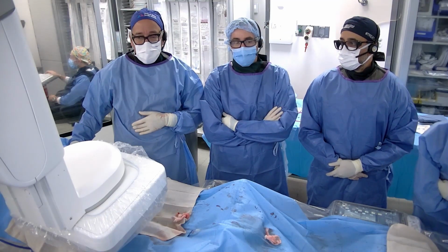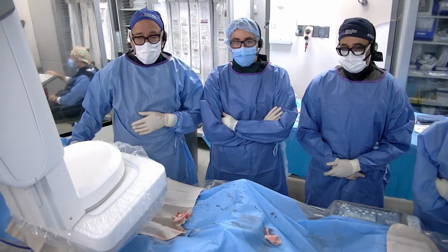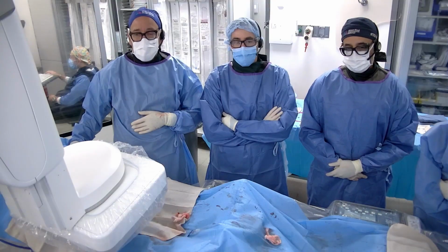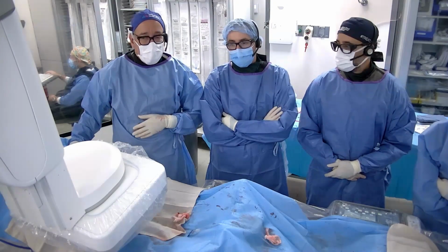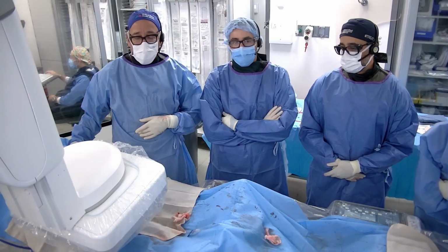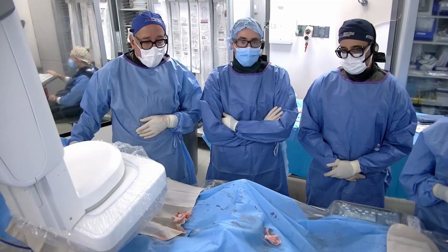Yeah, I agree. I'd put a 6X down there, see how much I could suck out, and then I really love IVUS. I think that run was really valuable information, so then I'd re-IVUS again and then decide whether I could get away with just drug-eluting therapy or if I had to scaffold. I would advocate for aspiration and then angioplasty.